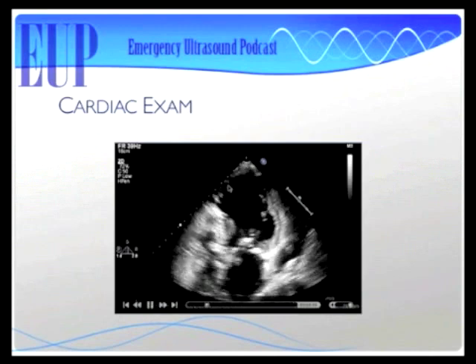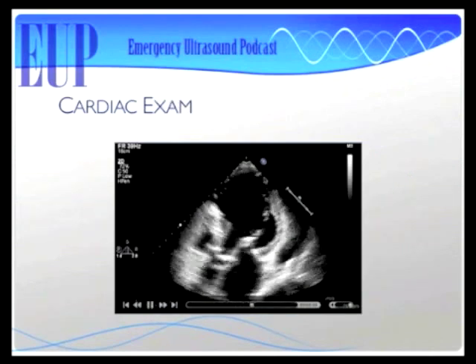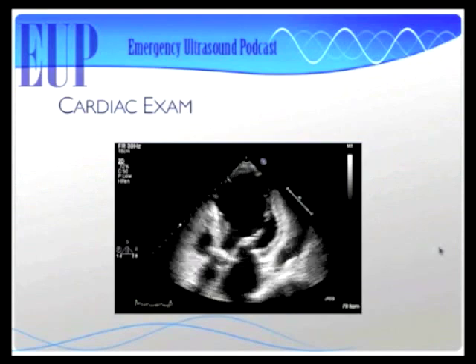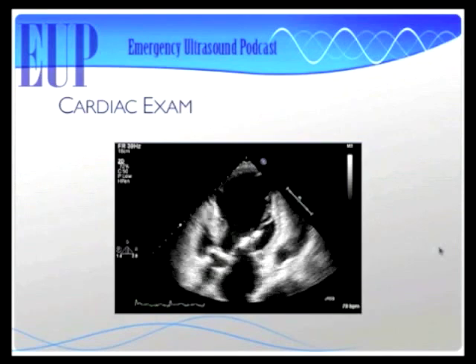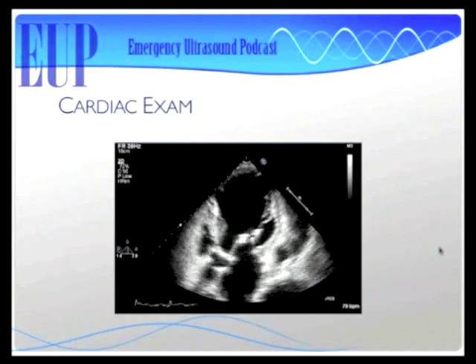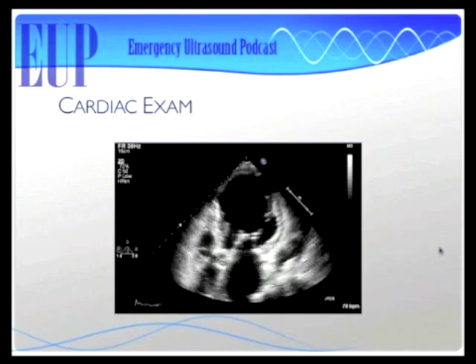Right, yeah, nothing significant. So this person's ejection fraction is pretty poor. It's definitely diminished, and they don't have very good squeeze. So that's what I would want you to pull out of that image. Really, that's it. There are some other findings on there, but let's just look at it and say, hey, that heart's not squeezing right. So in the next one, here's another one.